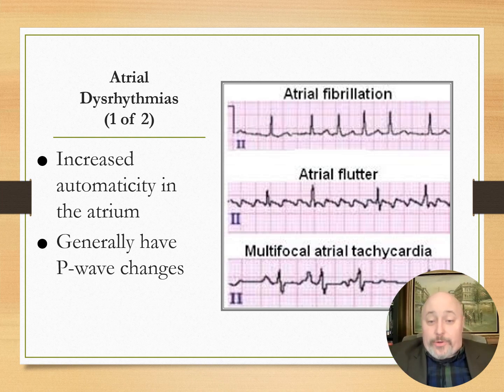Moving down to atrial flutter, on the other hand, that's going to cause those big sawtooth-like P waves that have irregular QRS complexes occurring in between. The reason that's occurring is in the case of AFib, they're not getting the signal for a contraction. So the atria are just sort of quivering on top while the QRS, the ventricles, are still contracting.